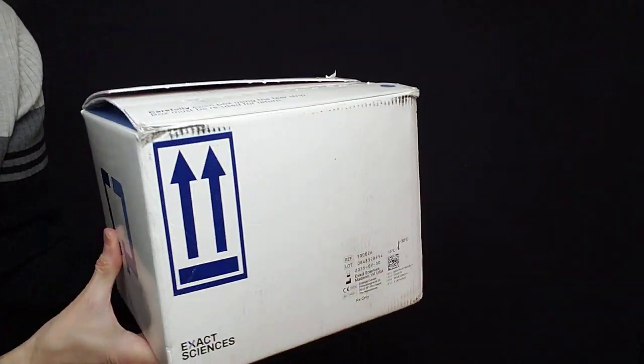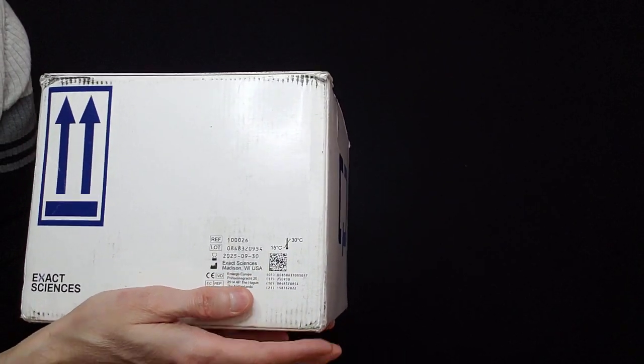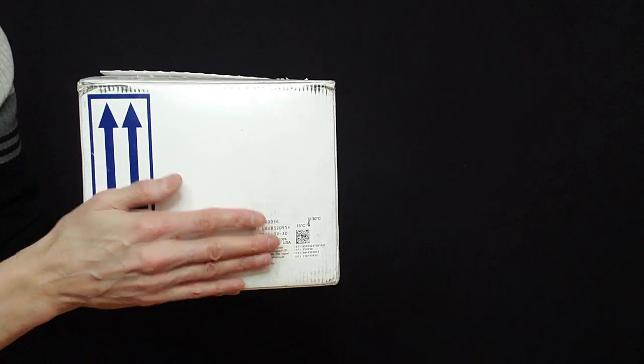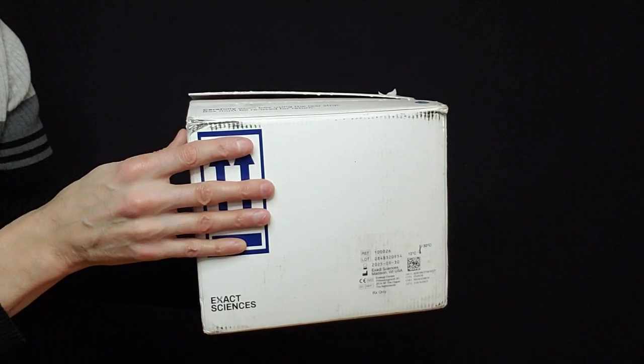But first, I want to show you on this box there is a date. You want to make sure when they send you this box that this date is not out of date, because there are some liquid preservatives in here that you need to use. So you want to make sure that's not out of date.